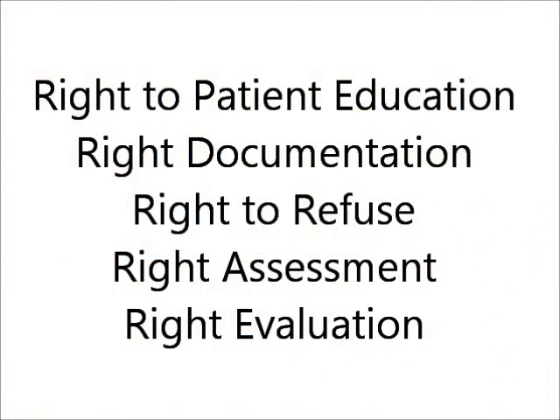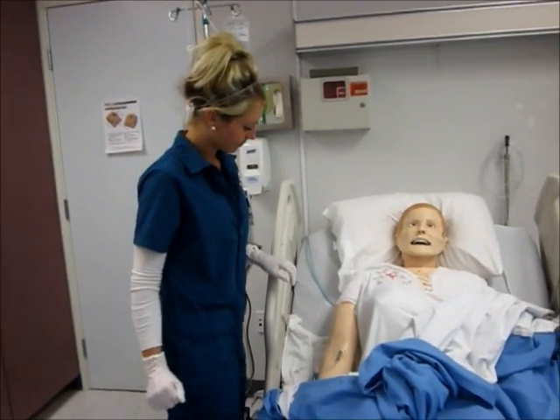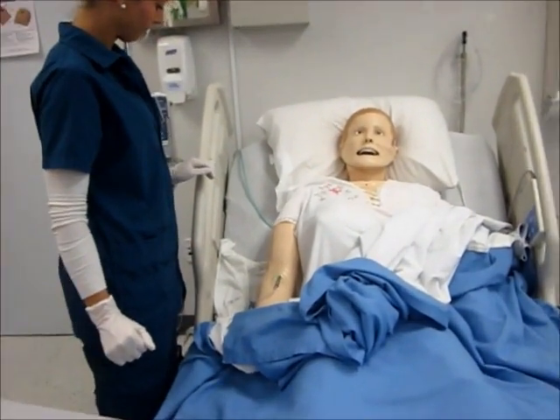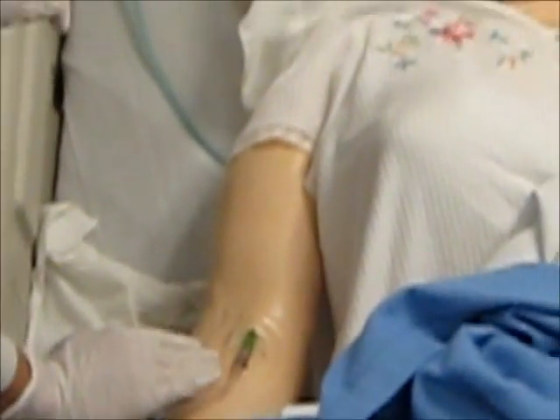At this point, the nurse will complete the other 5 rights to medication administration. These include right to patient education, right documentation, right to refuse, right assessment, and right evaluation. After applying gloves, the nurse will assess the patient and monitor the IV site for redness, edema, and dislodgement.